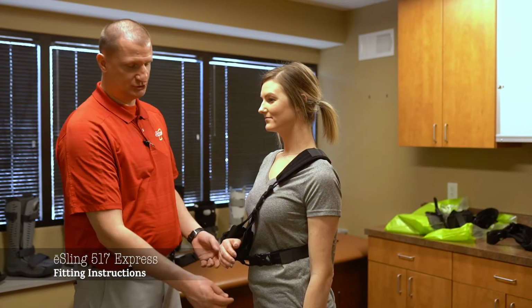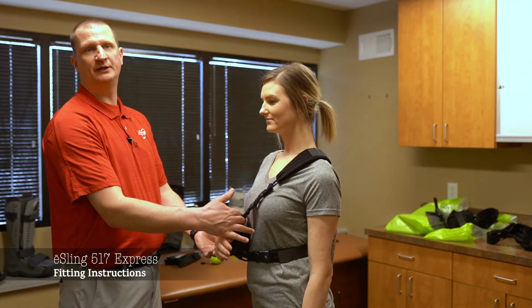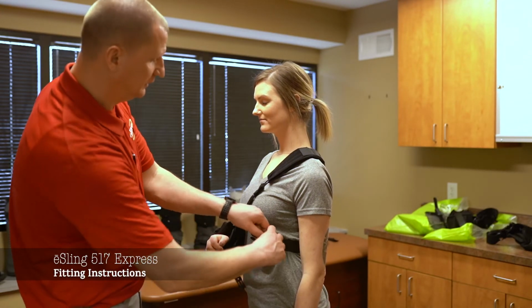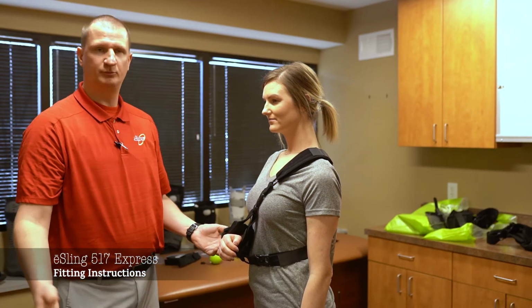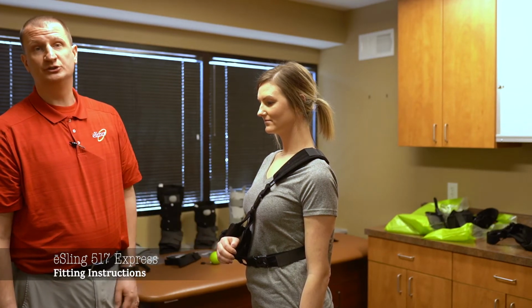An alternate connection for the waist strap, besides it being up here on the crossbody strap, we have just moved it to below the arm cradle. So this attachment can either go up to here with the clip, or you can bring it down here. Whatever is most comfortable for the patient, or preferred by your physician.